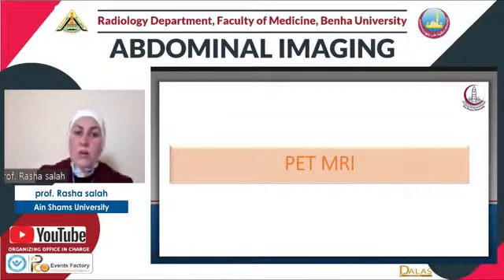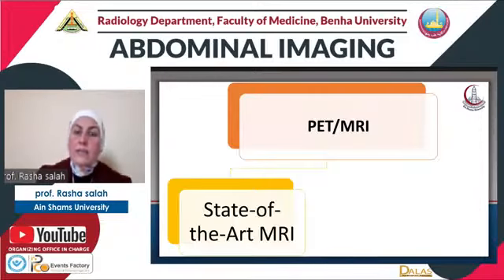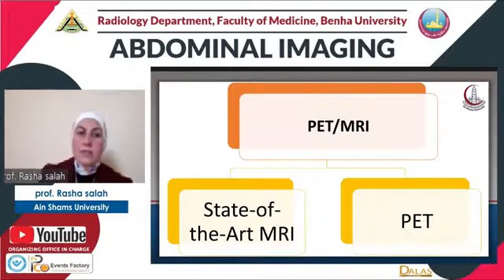The new MR modality included in the PET MRI is very helpful in staging and restaging of rectal cancer. PET MRI combines the high-end machines, including the state-of-the-art MRI for proper rectal staging, including the mesorectal involvement, and also for assessment of nodal disease, and it includes also the PET component for assessing distant metastatic lesions.